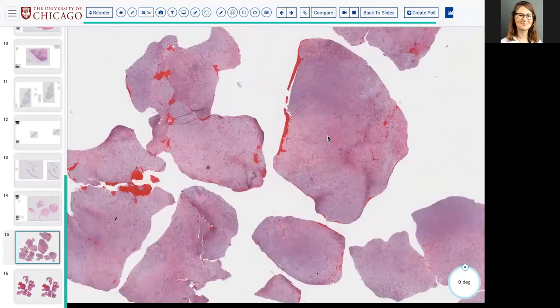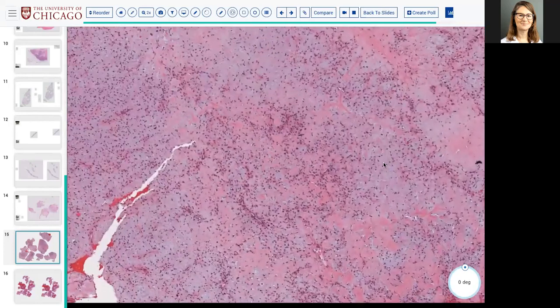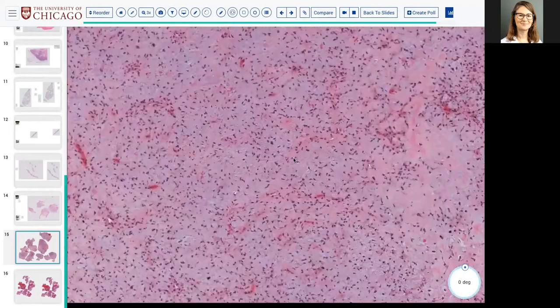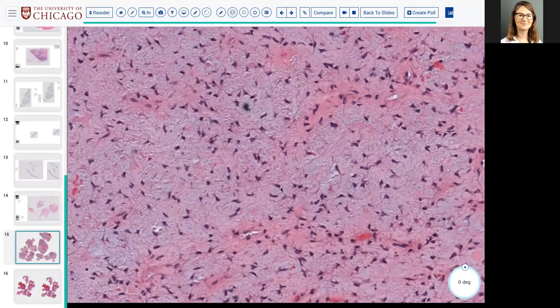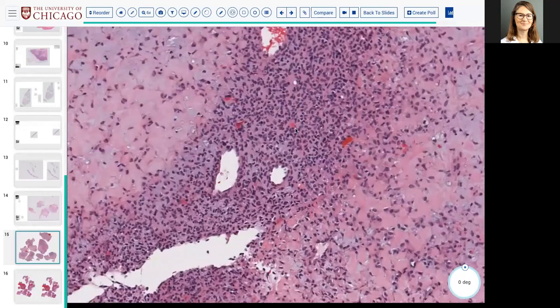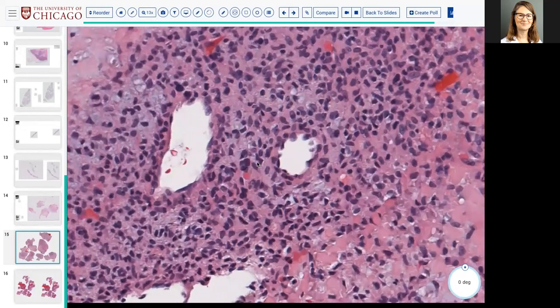And so you may get this for frozen, because in these bony lesions in kids they will already have an indication that this might be a CMF. But if you see this bland cartilaginous or myxoid type of tissue with these cells that aren't quite interdigitating, but arguably have stellate cytoplasm, a great indicator of CMF are these hypercellular areas at the periphery, where sometimes you can see multinucleated giant cells.